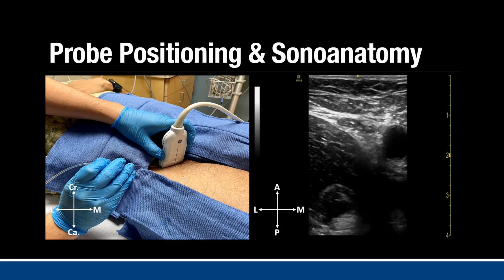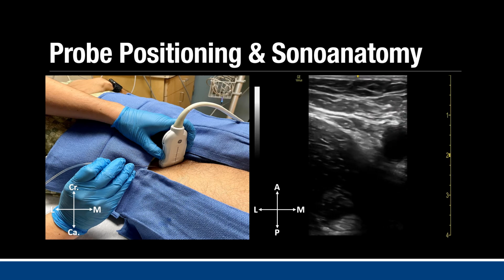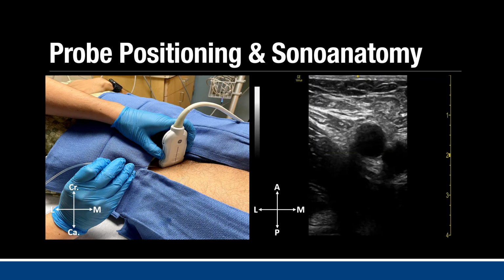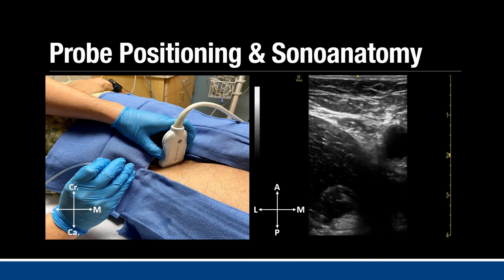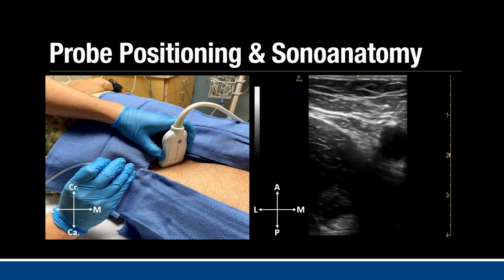One can also see the hypoechoic iliacus muscle with 2 overlying hyperechoic stripes corresponding to the superficial fascia lata and the deep fascia iliaca that is just above the iliacus muscle. In the far field, the psoas muscle can be appreciated with the hyperechoic psoas tendon just above the iliopsoas notch of the iliopubic rim.